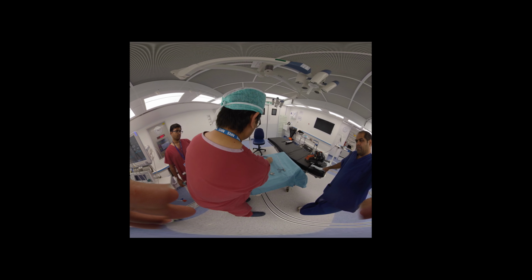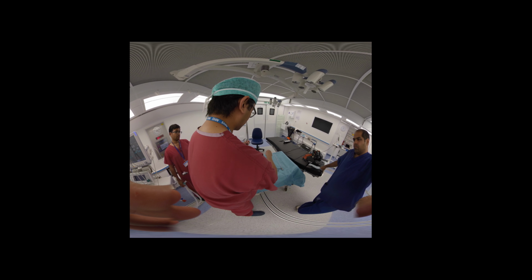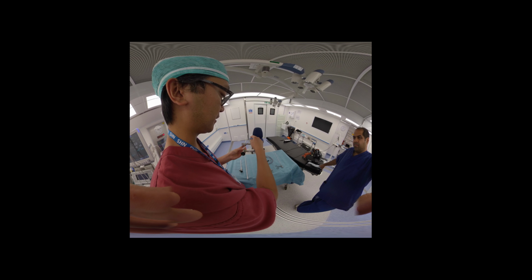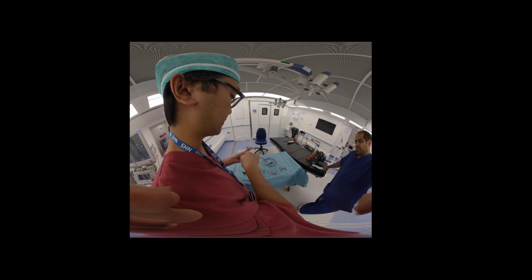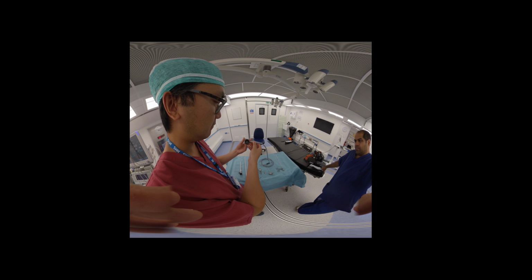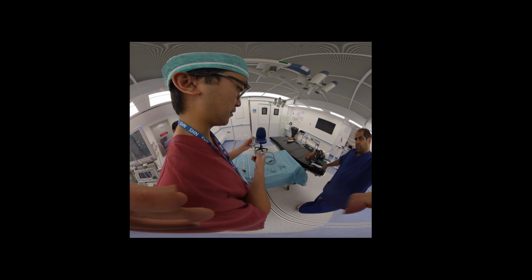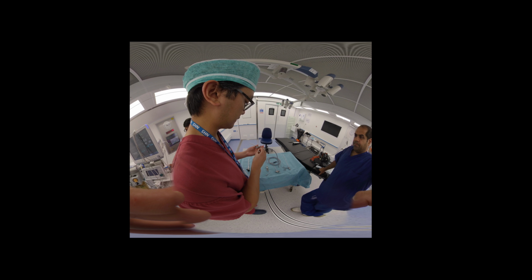Actually, before you do that, attach the light source as well. So make sure that the light lead is attached into the light source. You have good illumination, and at this point, you want to put the light source directly onto the endoscope, not onto the bronchoscope, because of course your endoscope is now going through the bronchoscope. There's no light coming from this light bridge. So that is the assembly you want set up when you go to do a bronchoscopy for diagnosis. The other piece is for the side port, which is typically used for suction.